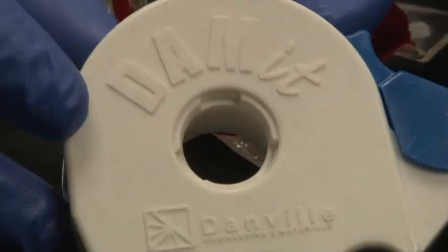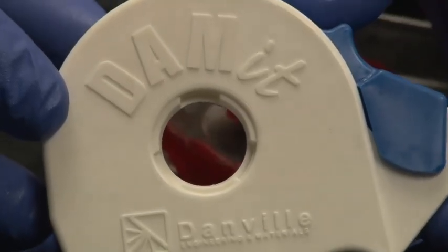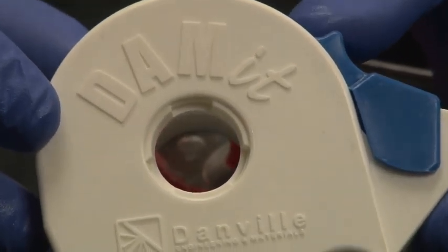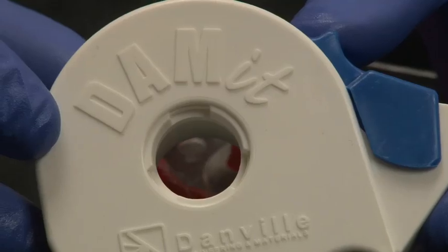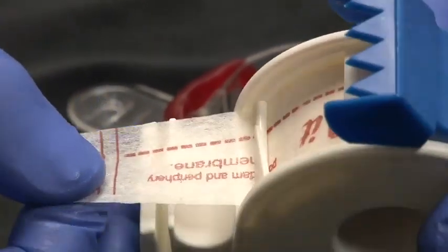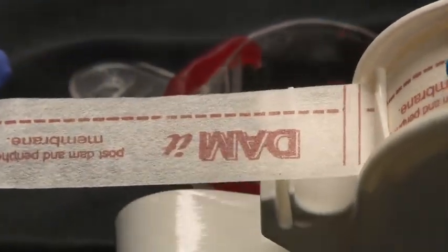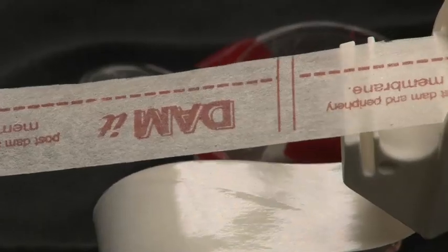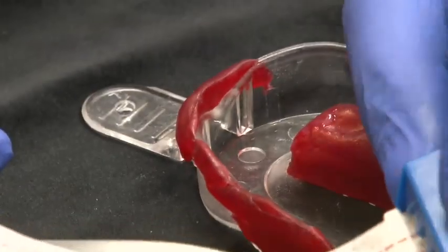You see it right here. It comes from Danville Dental Products, which is really great products. And one of them, this one here, is almost like a thin masking tape. It's marked for us. We just cut it.